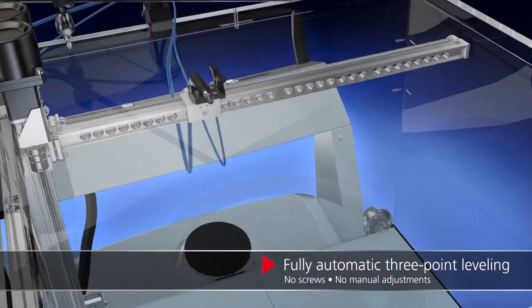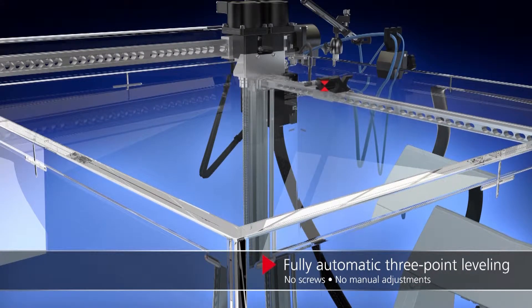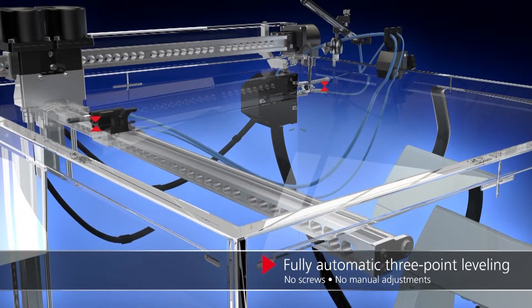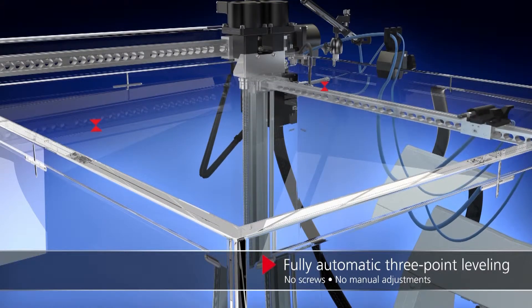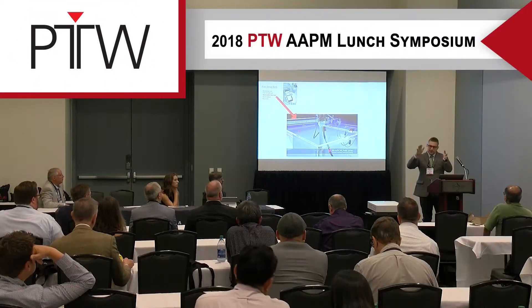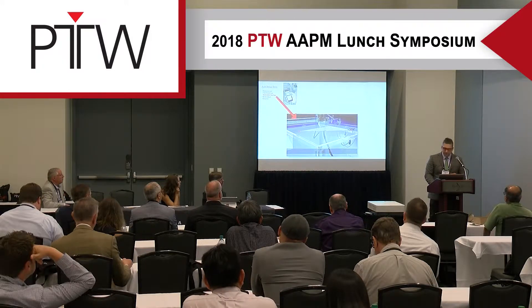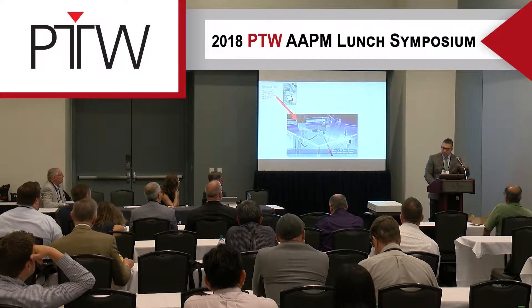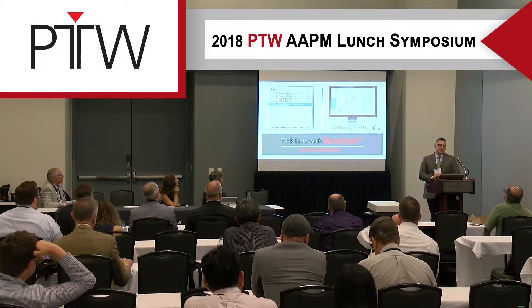The auto water leveling is slightly different from other tanks because it uses actual electronic-based sensors. It moves the arm mechanically to three points, internally collects the position at each measurement, and uses that information to calculate the leveling of the tank. Ordinarily you'd use a spirit level on the tank sides, but here it's an integrated feature. If you're curious how well it works, I'll show results in a few slides.